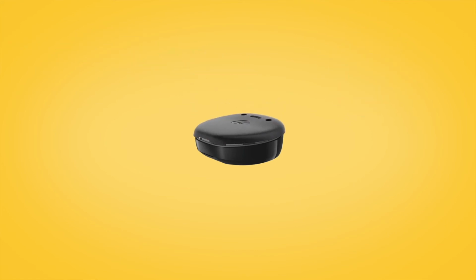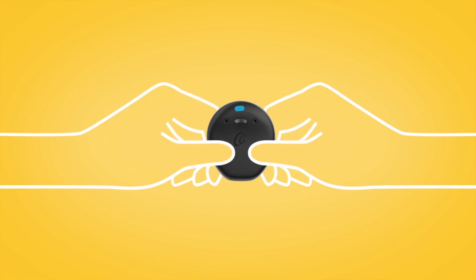Then, place a new cover on your sound processor, ensuring it lines up with the sound processor body properly. Lastly, press around the edge with your thumbs to make sure the cover is properly sealed.